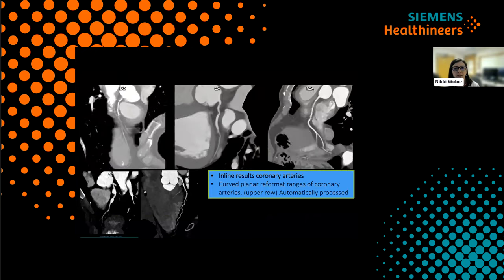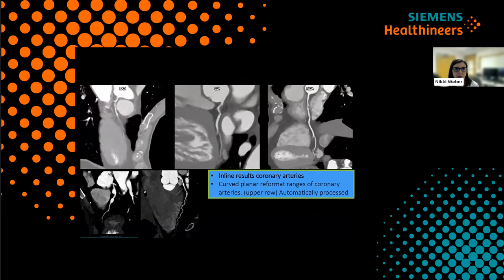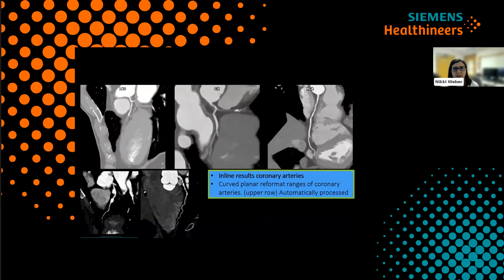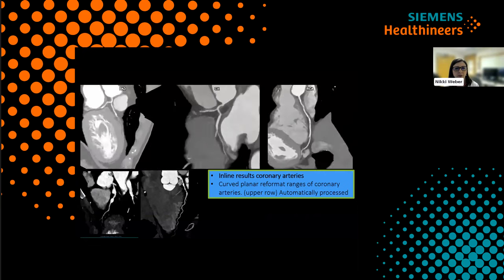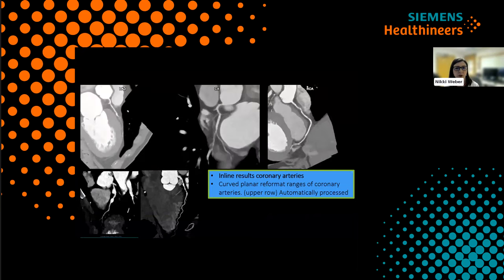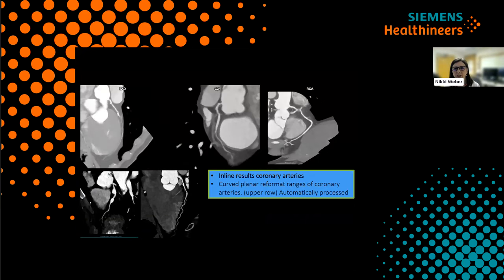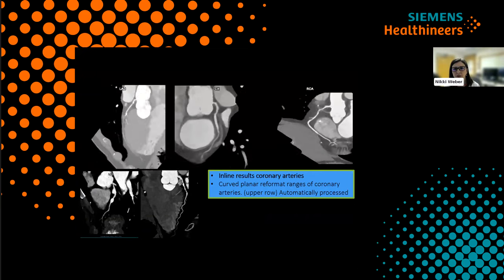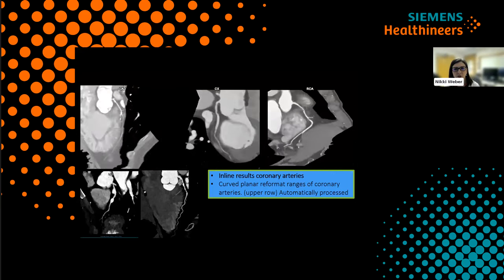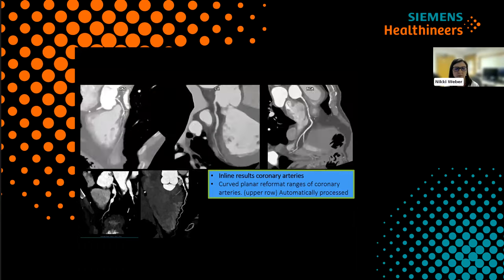Curved planar reformats can be instrumental in looking at the vessel. Again, being produced by the scanner can be a time saver for whomever is creating the series, whether it's techs at the scanner or a 3D lab, or even the reading physician. The scanner uses built-in anatomy detection to create these images. I would suggest making sure you edit the ECG if necessary before starting these recons.